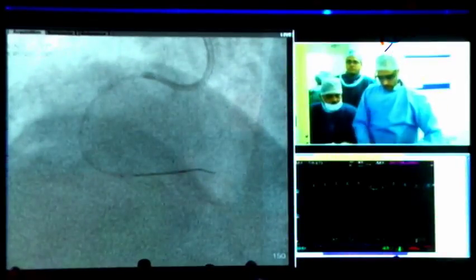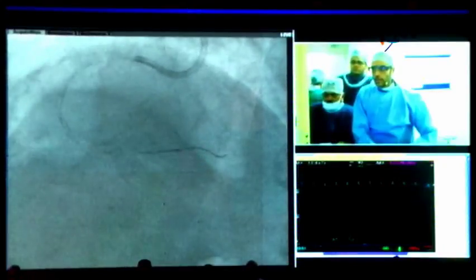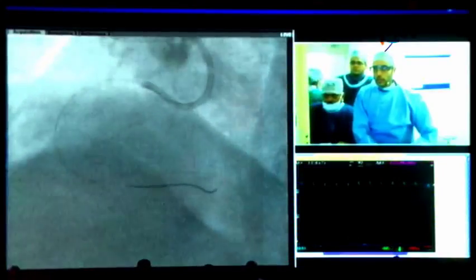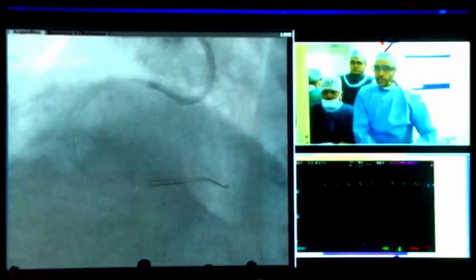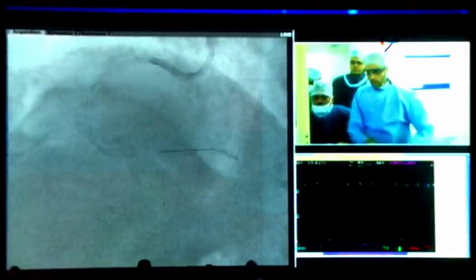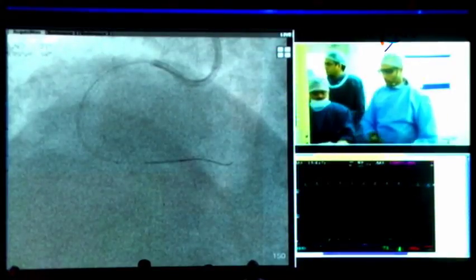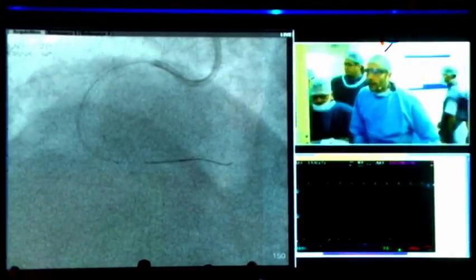Careful. It looks like your wire is beyond the crux. Yep. No, the distal edge is beyond the crux. I don't think the proximal edge is beyond the crux. I don't know. Whatever. You can go live, guys. Yeah, go. Flush it, please.